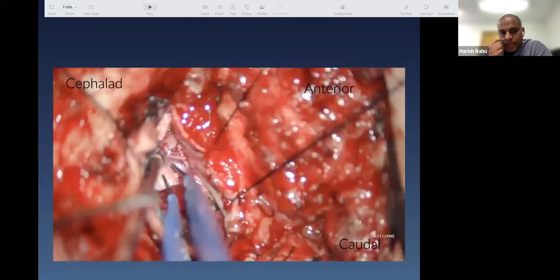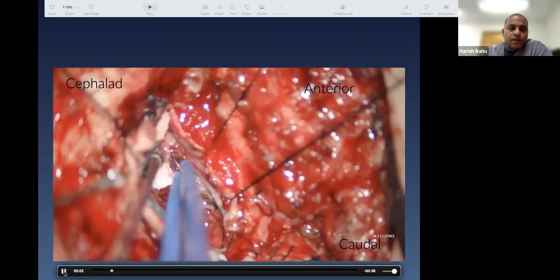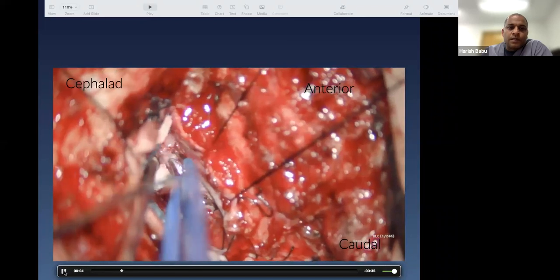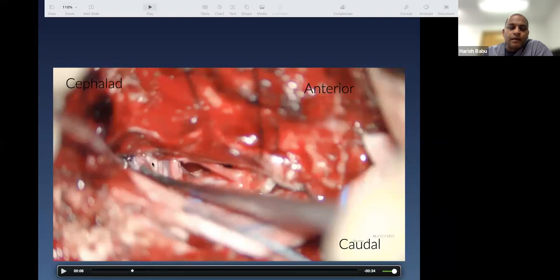Surgical orientation: cranial-cephalad, caudal, anterior right side. The dura is opened and tacked up, with the cerebellum and medulla visible. Tumor is seen being dissected between the rootlets of CNs 9 and 10. CN 11 is visible with a window through which tumor was removed. The vertebral artery is clearly identified throughout. In these cases, you work through multiple windows between nerve rootlets and neurovascular bundles.